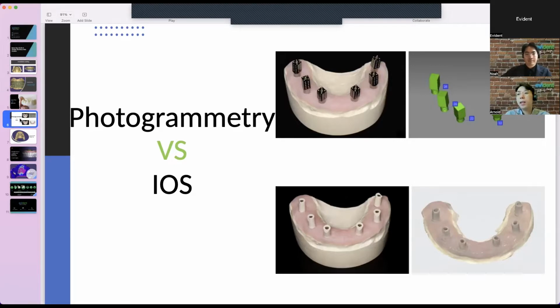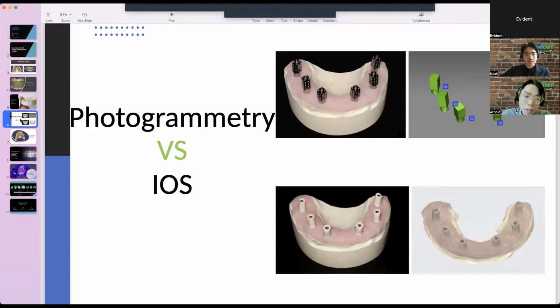So in that case, we can utilize IOS very well, because I have a dentist who does same day with us, and he just uses an intraoral scanner, and the fit accuracy is perfect because it comes from experience. It's just the same as taking impressions, right? If you take good impressions, then you have no problem with open margins when the lab fabricates for you. But if you take a poor impression and send it to the lab, even though they do a good job, you'll have open crown margins, right? So it really depends on your experience and your recipes. It comes from your own perspective.